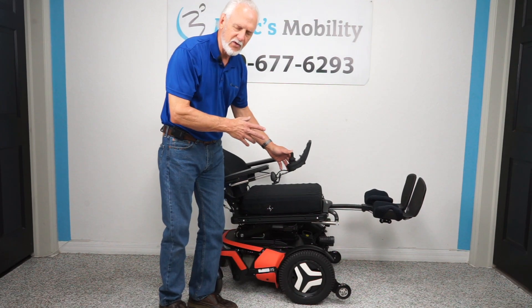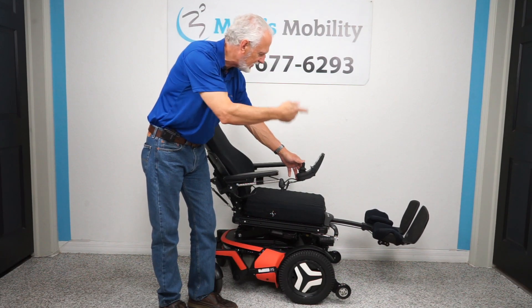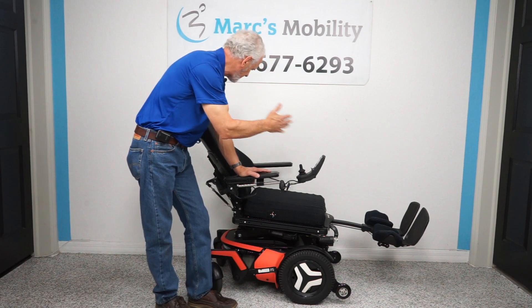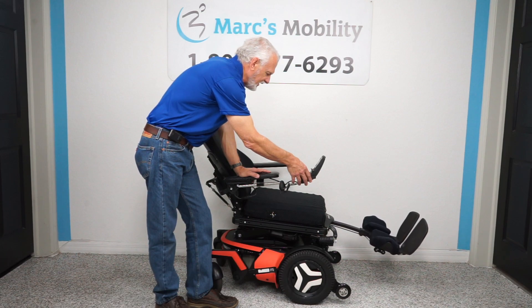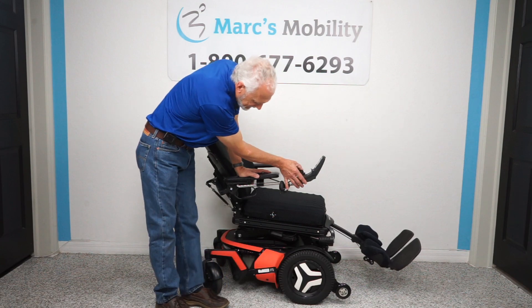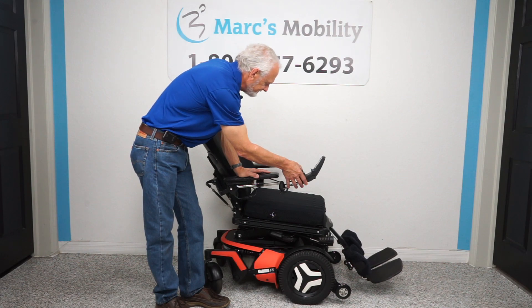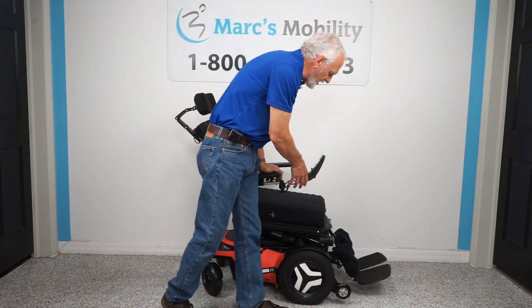These chairs can be programmed — if you want the back and the legs to go down at the same time, all that can be adjusted. We've now done the seat lift, the tilt, and the feet. When you're outside, leave those legs out a little bit.